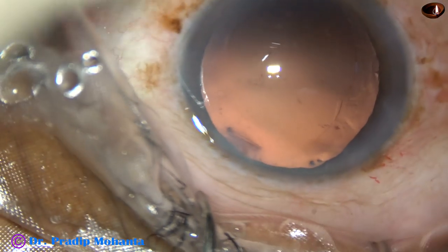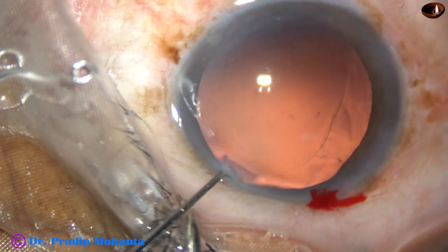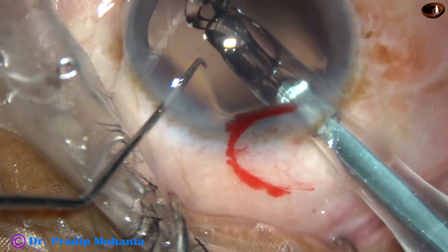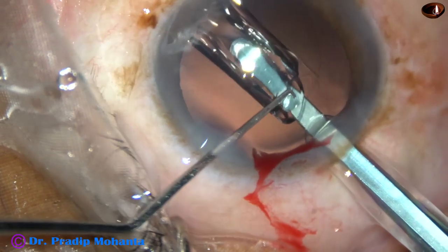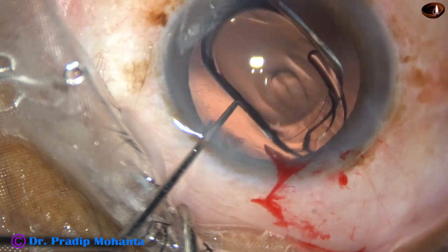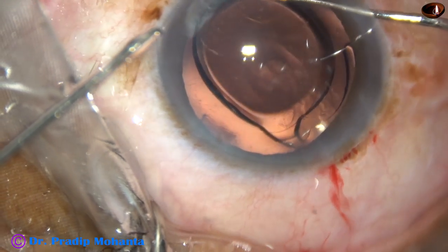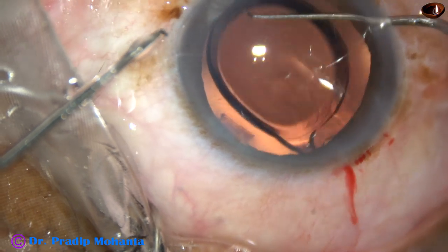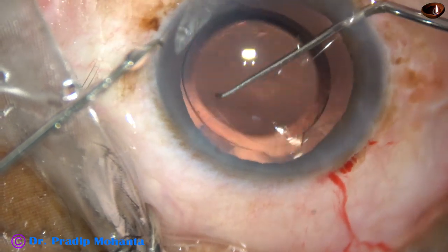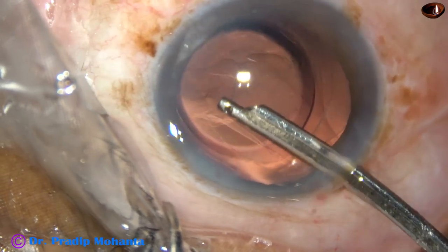In this case, a single-piece hydrophobic intraocular lens is being placed in the capsular bag. Here goes the lens. The lens has gone into the capsular bag. Both haptics are in the bag. It is being checked by a Sinsky hook — if we can hook the rhexis margin just over the haptics, then it is confirmed to be in the capsular bag.